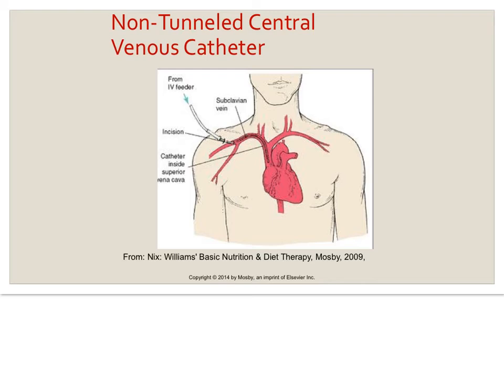This is a picture of a non-tunneled catheter, and as you can see, the catheter itself immediately enters into the vein, so no portion of it is tunneled under the skin, but it too will rest in the superior vena cava just outside the right atrium.